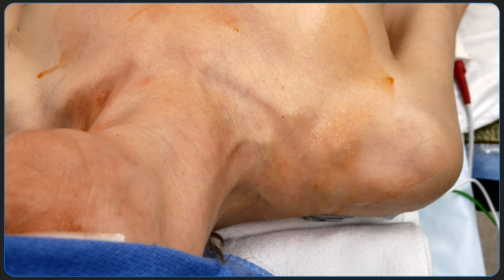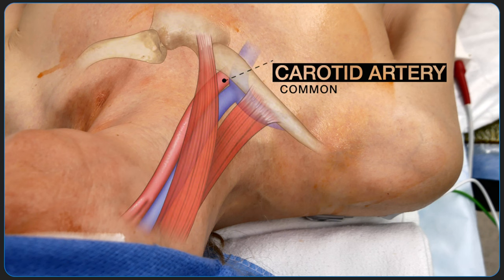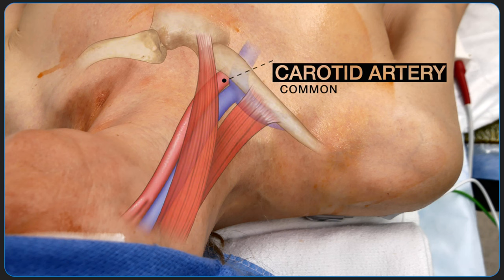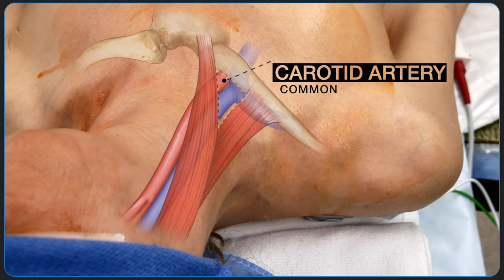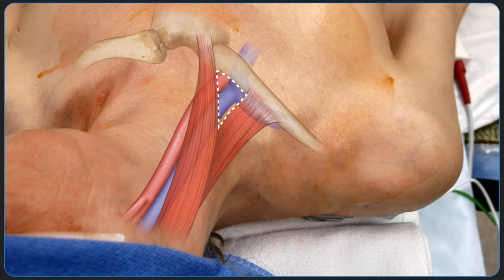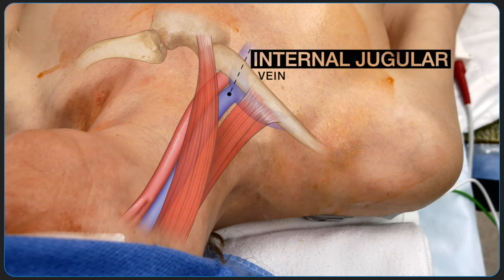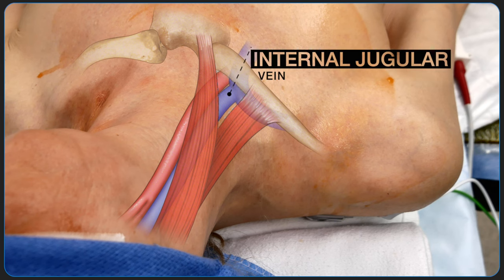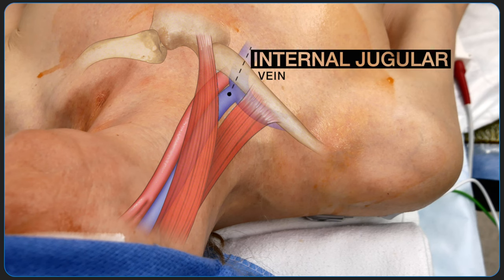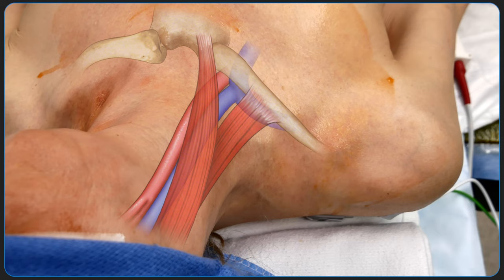Using surface landmarks, the common carotid artery can be palpated in the triangle formed by the two heads of the sternocleidomastoid and the clavicle. The internal jugular vein often travels lateral to the common carotid artery in this space.